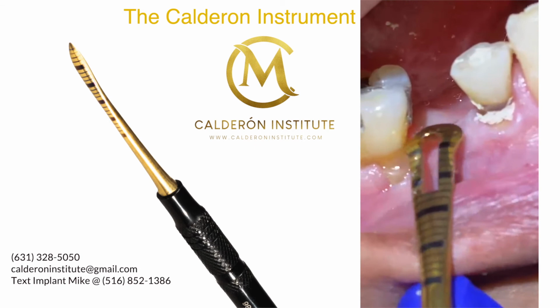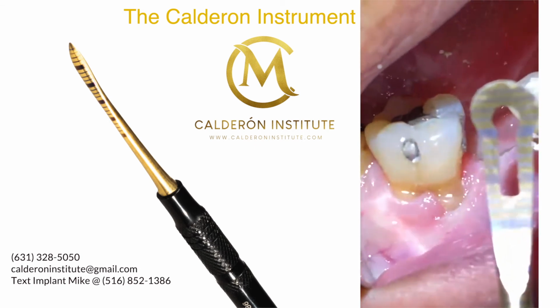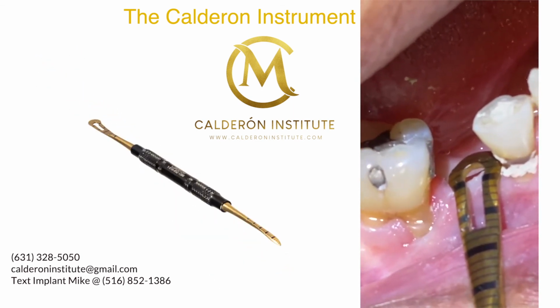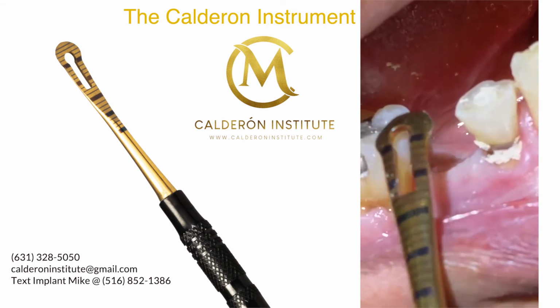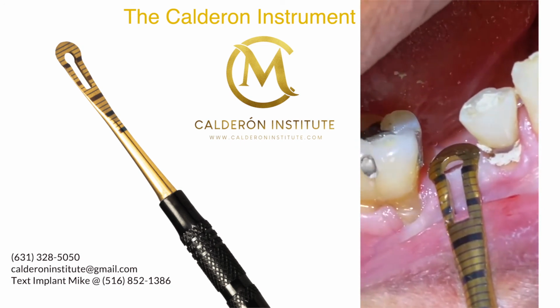So now the question is, where do we place it? With this trusty instrument, we know the distance from one end to the other is 7 millimeters. So I can put it right against this tooth and I know where I'm going to place it. So I want to go dead center, so I can place that there. When I crown this tooth, everything is going to look beautiful. So that's dead center right there.